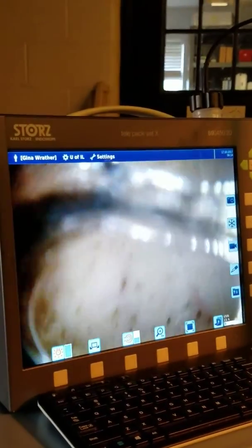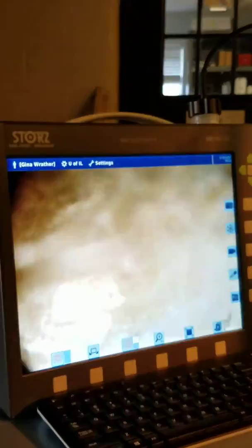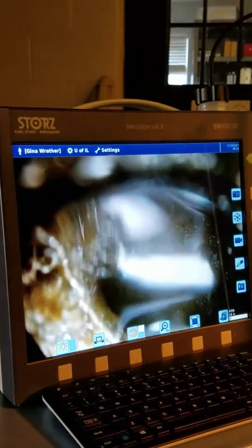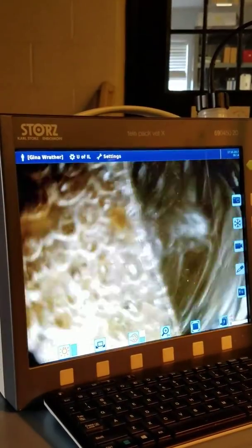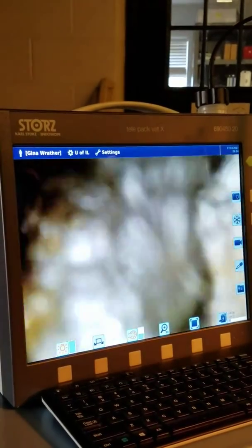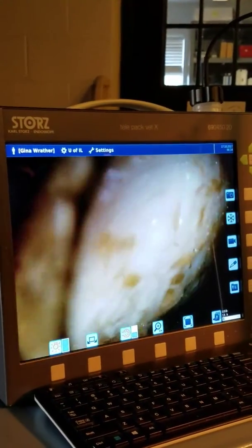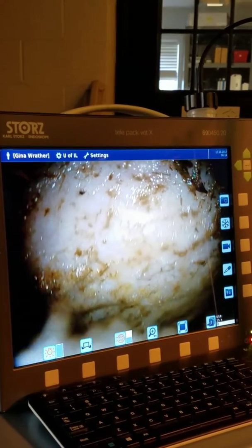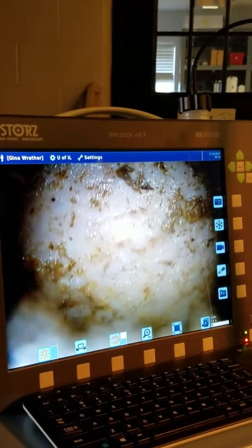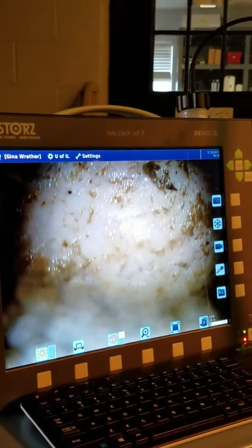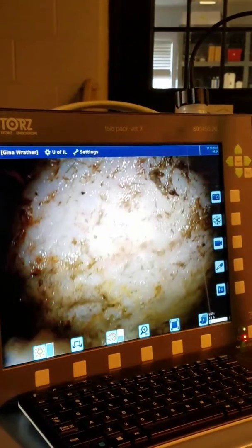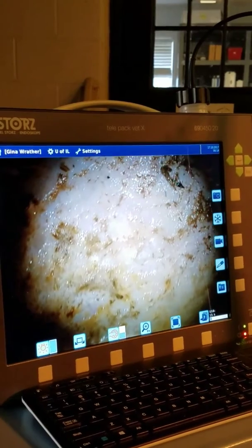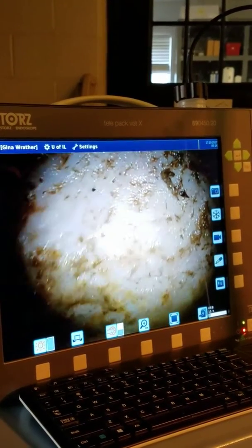So now we are in his stomach. We're going to put a little air into his stomach so we can look around more easily. The part of the stomach you're looking at is the non-glandular part — it doesn't produce any acid, and that's also the part that more frequently has ulcers. Once this is blown up, you'll see a pretty distinct line between the non-glandular and the glandular part.